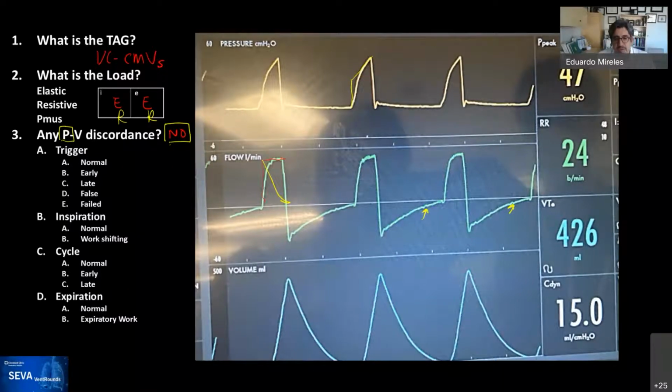I usually try to see if it happens at the exact same time as the heartbeat, and you can see that it's occurring practically at the same time. It can be secretions. It can also have a rhythm, and it can go with the heart of the patient. So sometimes increasing the gain will give you a little bit more evidence on what's going on with them. Yep. Thank you.